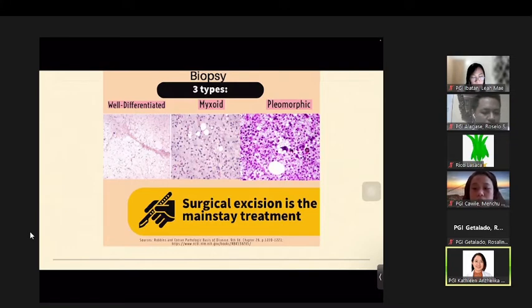Next, we have the myxoid liposarcoma, which contains abundant basophilic extracellular matrix, arborizing capillaries, and primitive cells at various stages of adipocyte differentiation, reminiscent of fetal fat. So, myxoid meaning mucoid, or it has a mucopolysaccharide matrix. So, we can see a mucopolysaccharide matrix plus adipocytes of various differentiation. So this is intermediate in malignant behavior.